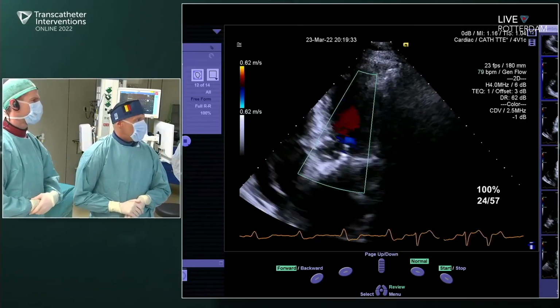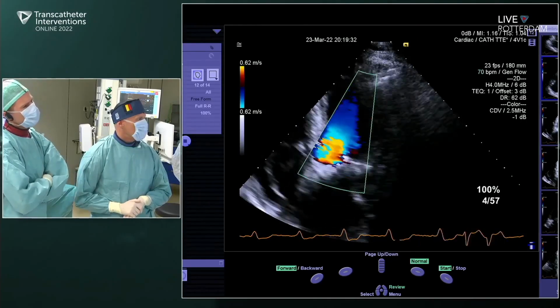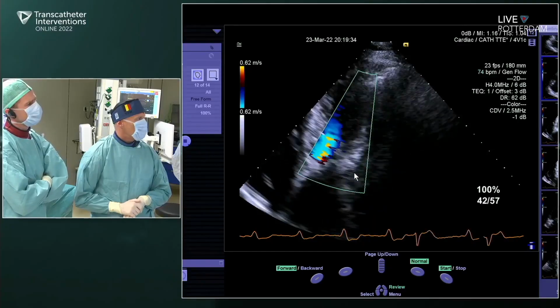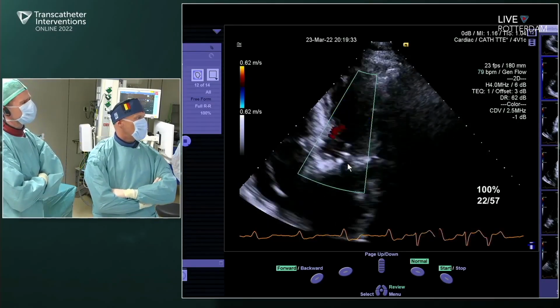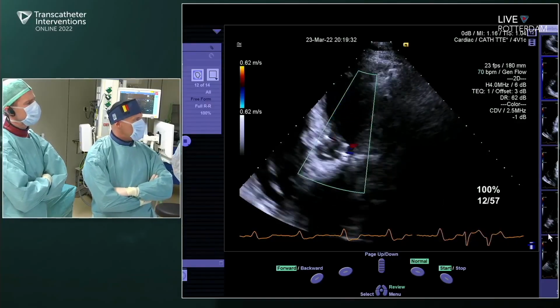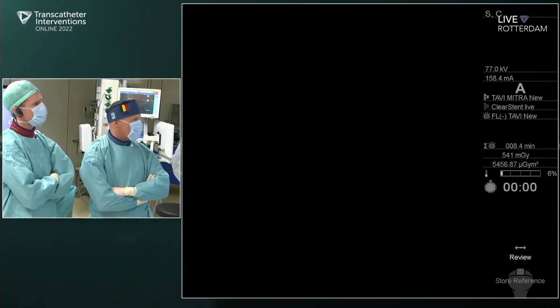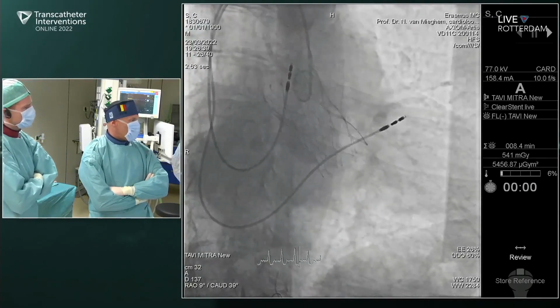And then after that, Claire, what did you see? So this is after the post-dil that we see the PVL was significantly improved, but we still see some jets over here. I would say it's trace. And then we made another angio, and can you show the final angio in the cusp overlay view? And there, all of a sudden, there's nothing anymore.